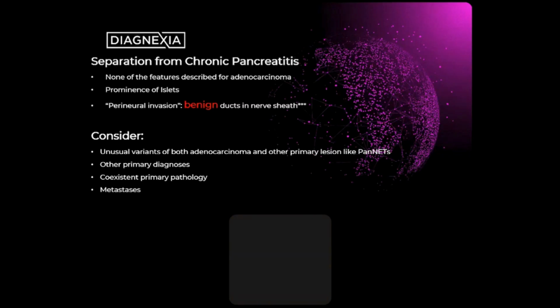Remember that pancreatic neuroendocrine tumors can have a ductular ectatic variant, which has large ectatic ducts present within the neuroendocrine tumor, and on frozen section can simulate an infiltrating adenocarcinoma. I've seen about 5 or 6 of these.